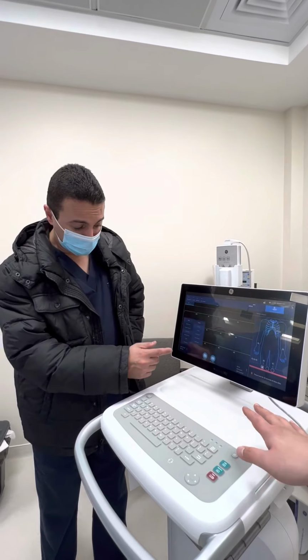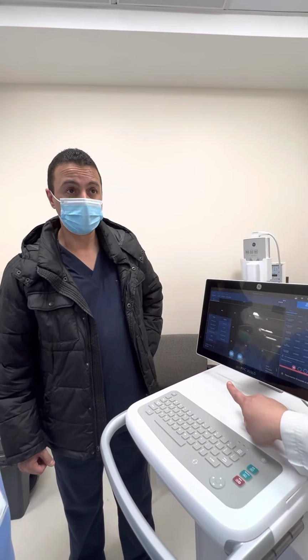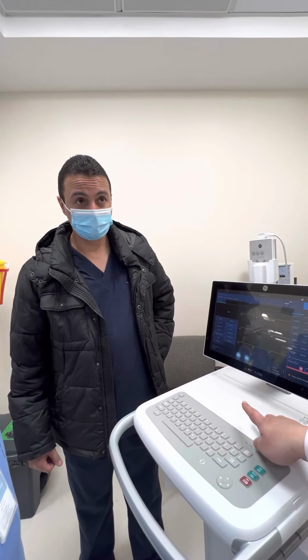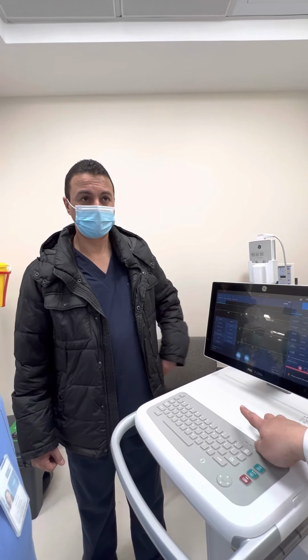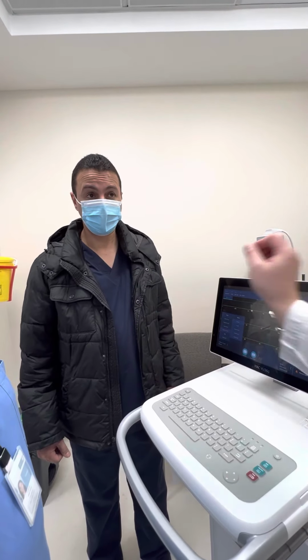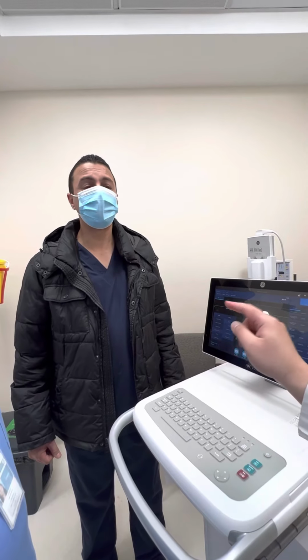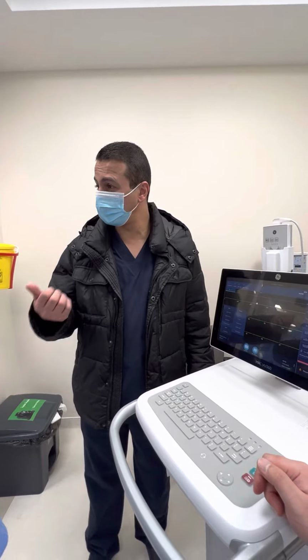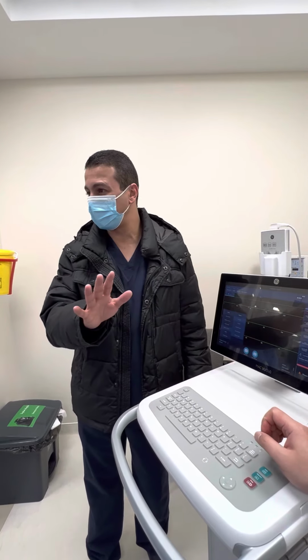So mainly, when will this machine be utilized? Once there is an order from the physician. Yes, exactly. Most of the practices of the triage nurses: some of the patients don't have a file, that's why they will not be able to order it. So what you are discussing is the second option, wherein you can hook the patient and print it, accept or reject. That is exactly. If there is no need to admit the patient, it will be in this machine only. It will not be transmitted.